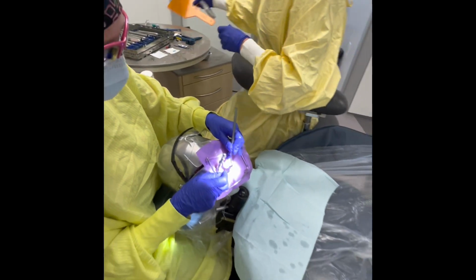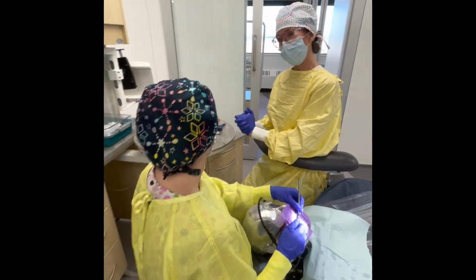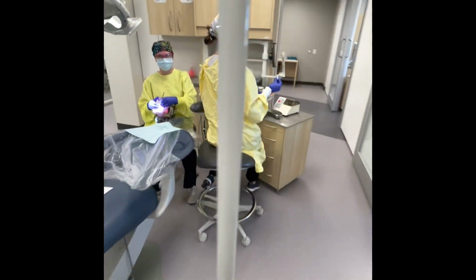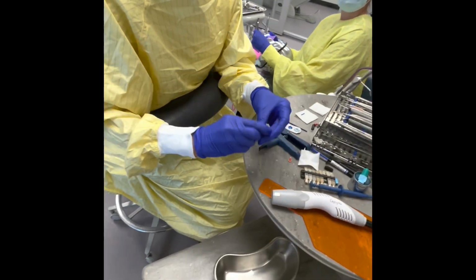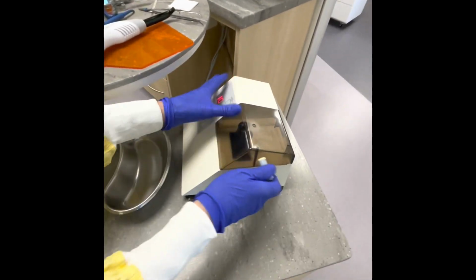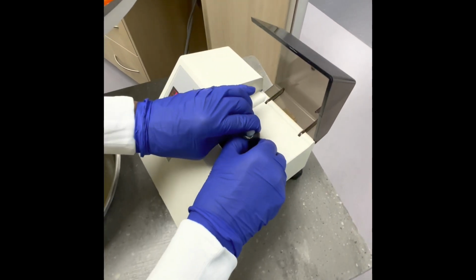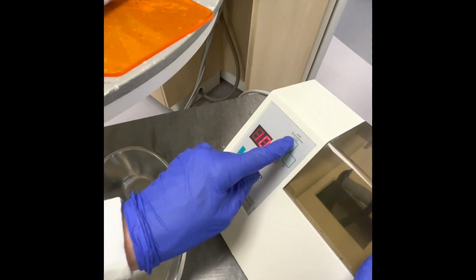Awesome. All right, so I am ready for some amalgam. Would you like a single spill or a double spill? We'll go with a single spill today. Okay. So some of these spills are a little bit different. This single spill, you just have to kind of click it in like so. And then what I'm going to do is just open my amalgamator, insert the cartridge, close the lid. It's set for 10 seconds.